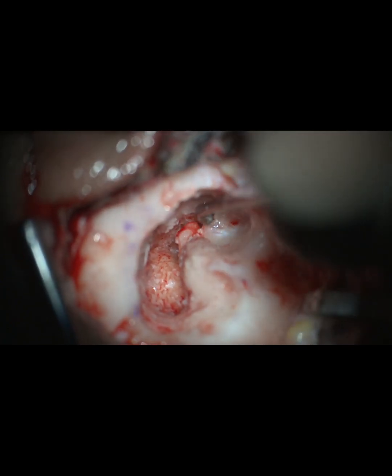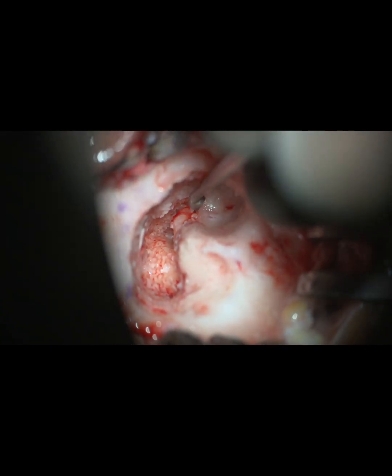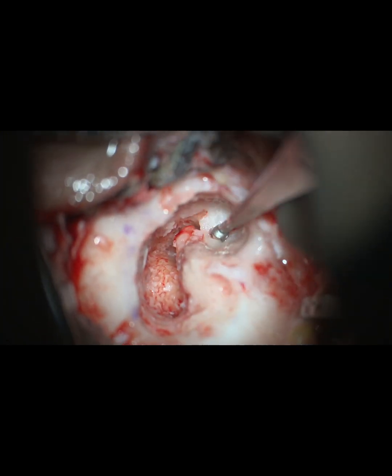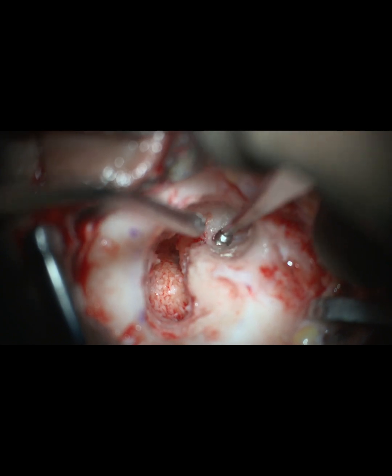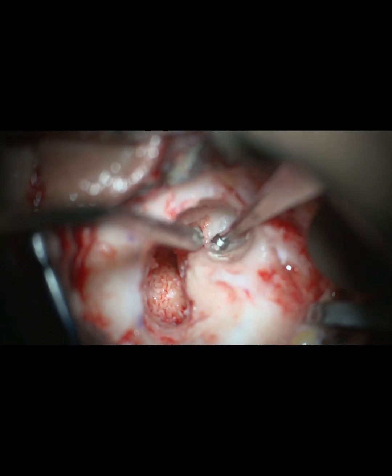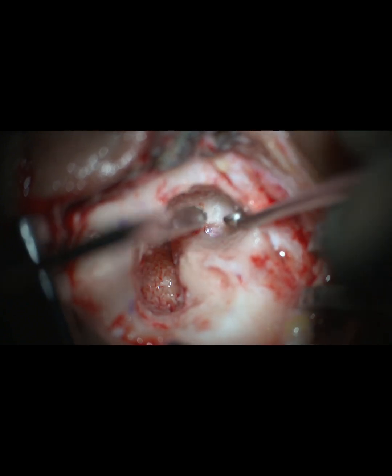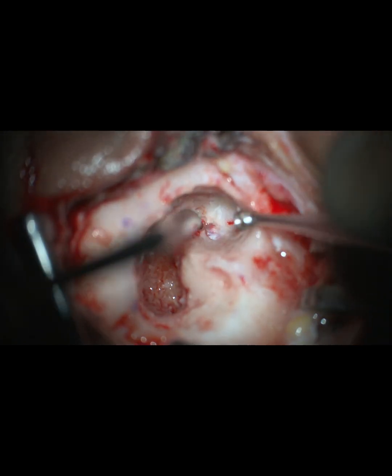The malleus handle was almost buried into this atretic plate, which was limiting the ossicular chain mobility. So after bringing this plate down, the ossicular chain was found to be mobile. You have to be careful while doing curettage at this place to avoid any trauma to the ossicular chain. Again, since we have already opened and seen the second genu of the facial nerve, we know now where the vertical part is lying, so we can avoid further damage.